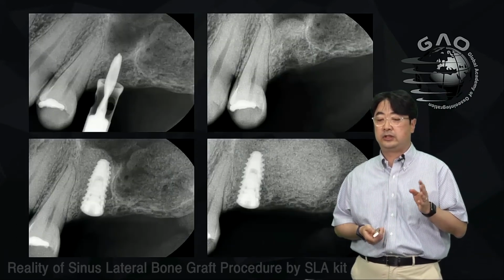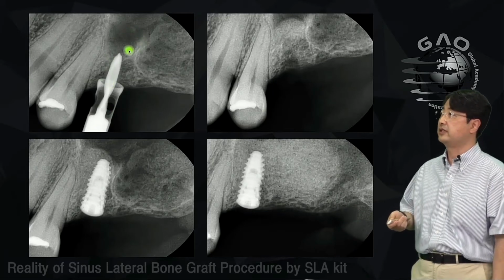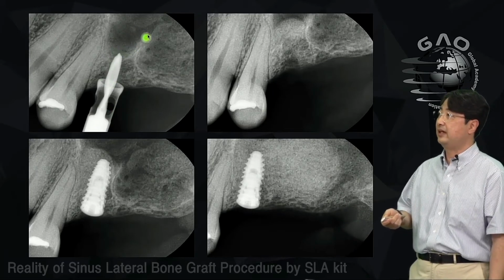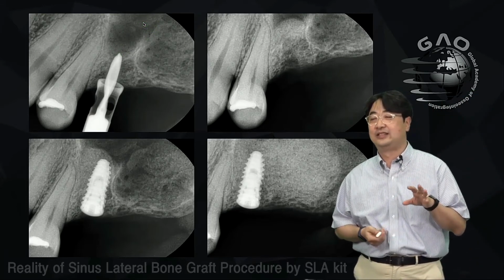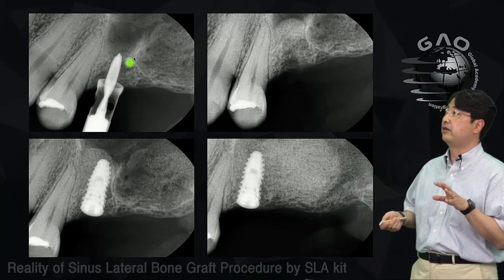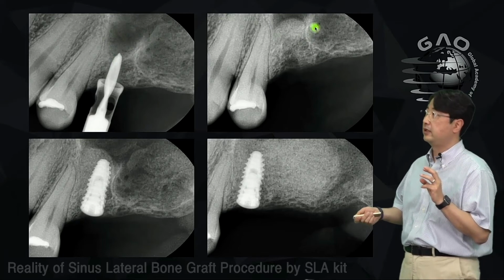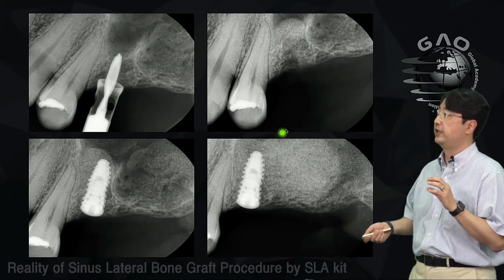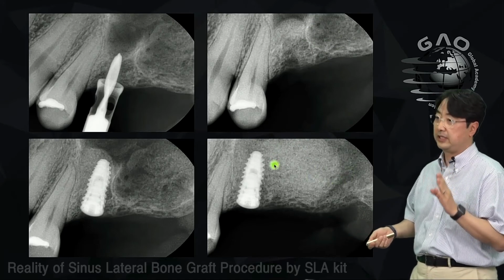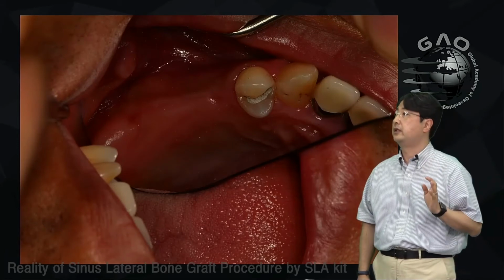Okay, so this is a radiograph showing I'm using the SCA and doing the bone graft from the crestal. And because of the septa, right? It's a very well-contained defect. So you can easily do the bone graft through the crestal for this area. But posteriorly, there is not much bone, so I decided to go for the lateral approach to fill the bone up to the septa, right? So this is a clinical picture like this.